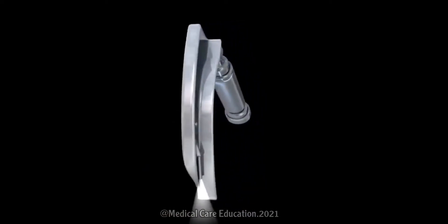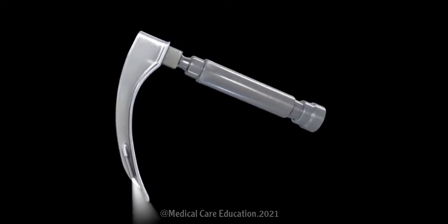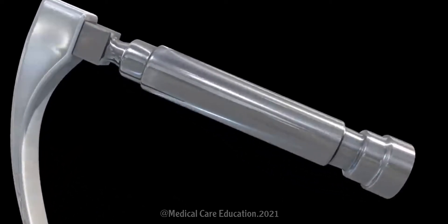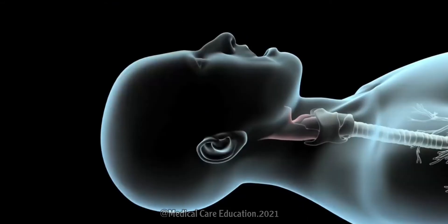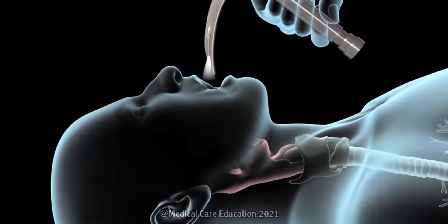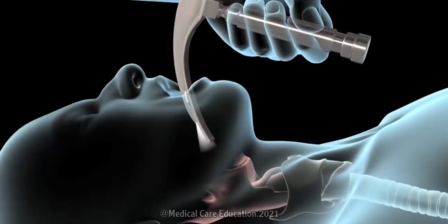The first step in mechanical ventilation is called endotracheal intubation. Once you're asleep, your doctor will use an instrument called a laryngoscope. This device helps guide the endotracheal tube to its proper position. Your doctor will tilt your head back slightly and insert the laryngoscope through your mouth and down into your throat, taking special care to avoid contact with your teeth using a special blade on the device.